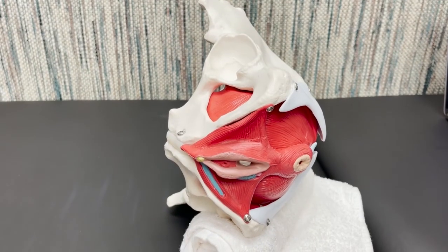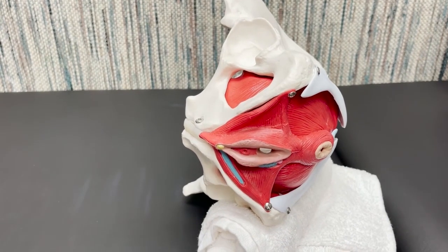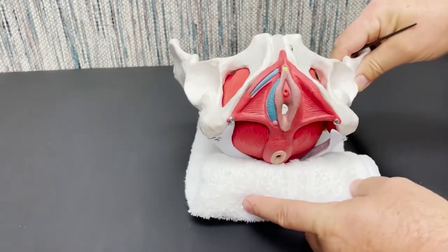The bulbospongiosus for the female. Here we're going to be in the supine position. So position here. And let's give it a little extra support there.